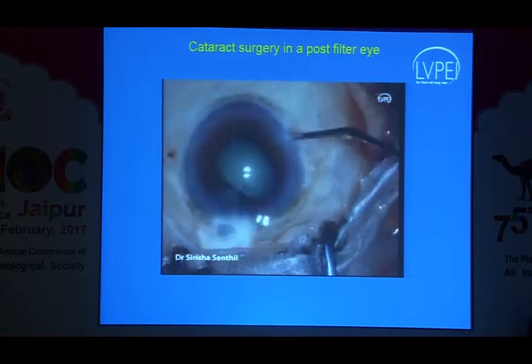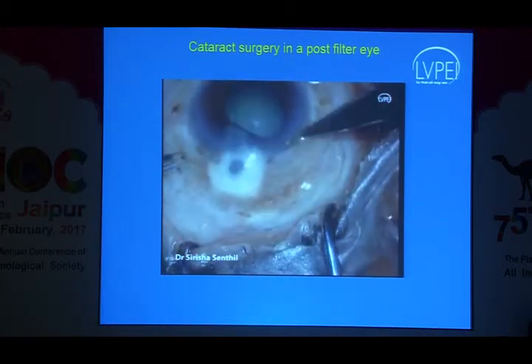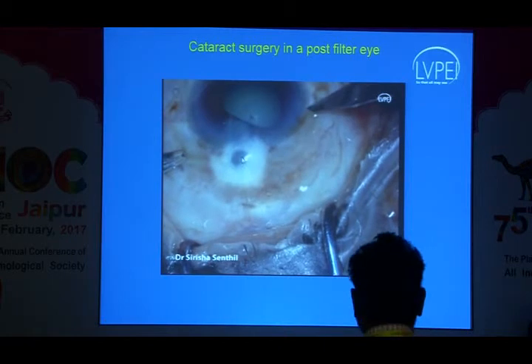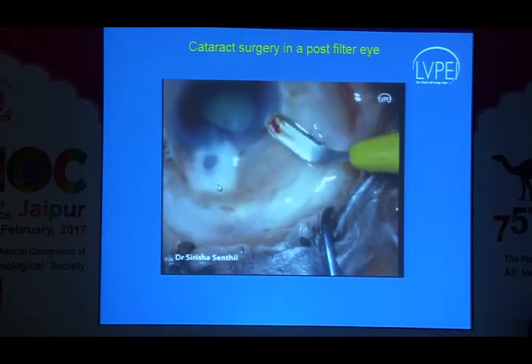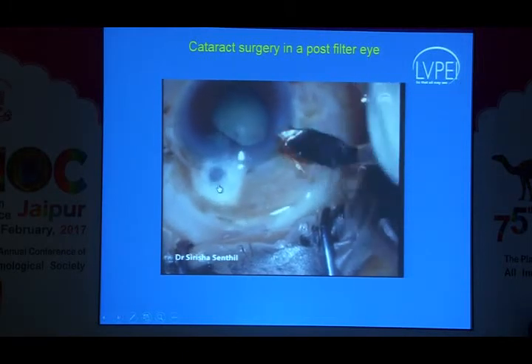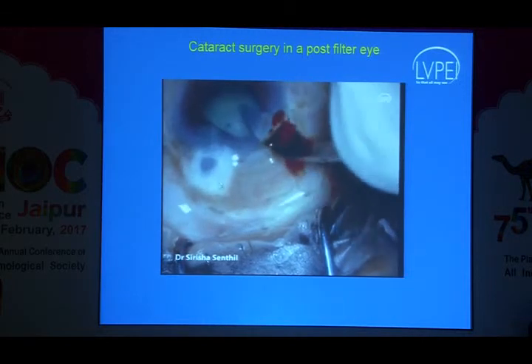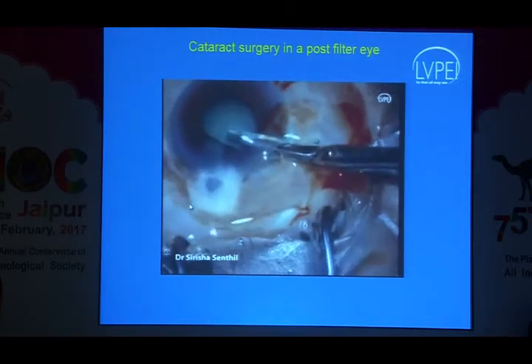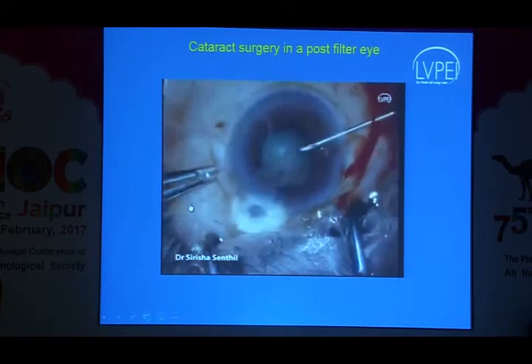This patient has a very, very thin cystic and a filtering bleb. You can see the large scleral defect that is there. There's no superficial flap also which is covering that. Most often in a situation like this, I would actually prefer to do a combined bleb repair with a cataract surgery. I would use a scleral patch graft and then remove this abnormal, thin conjunctiva, and either do a conjunctival advancement or do a conjunctival autograft along with the phacoemulsification.